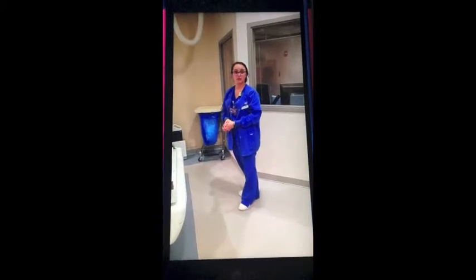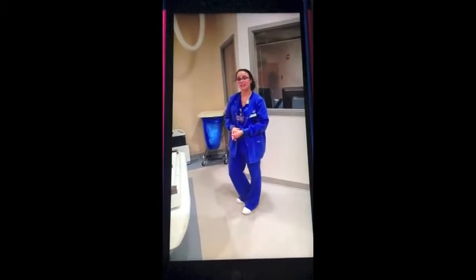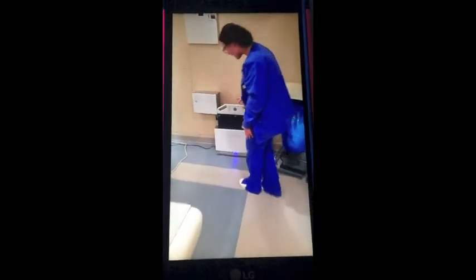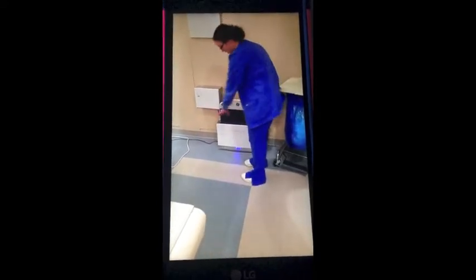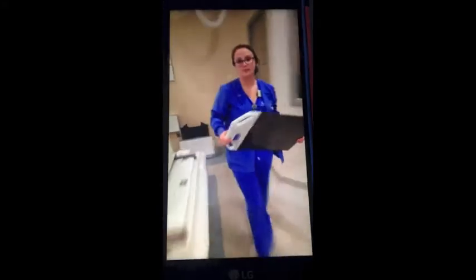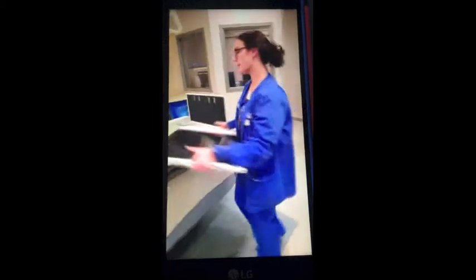Hey, I'm Holly. I'm going to show you guys how to use the digital cassette in room 2. So you're going to come over here. And if you're doing a small body part, you will not need the grid. So you'll just pull this out of the charger. And you're going to come over here, and you're going to have your patient on this bed.